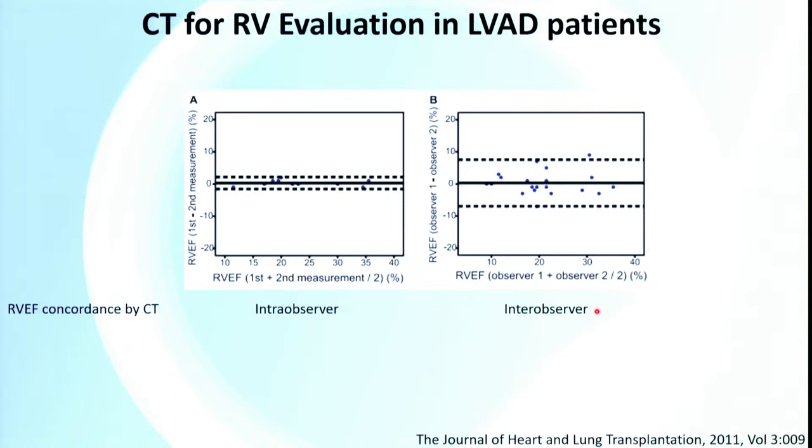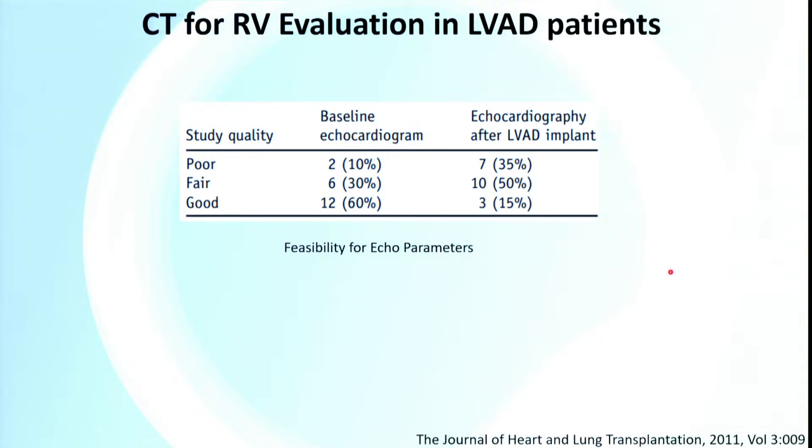This is the problem they highlighted with the echo, where the readers graded the quality of the echocardiograms pre-LVAD and then after LVAD. Pre-LVAD, 60% of them were graded as good quality, but that drops to 15% post-LVAD, and that's just a function of all the hardware that's there.